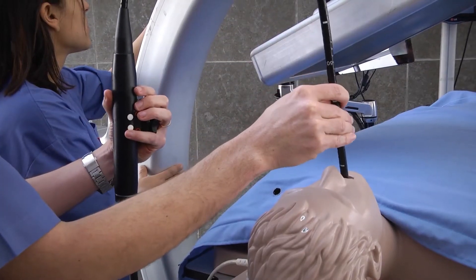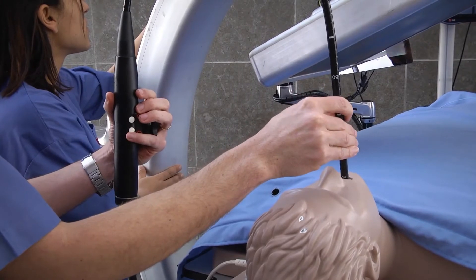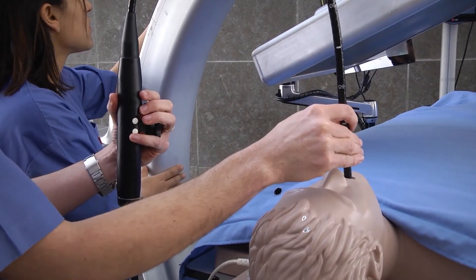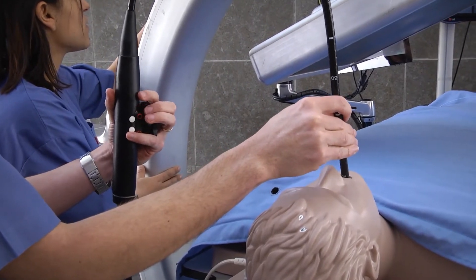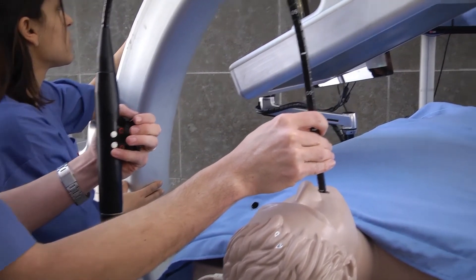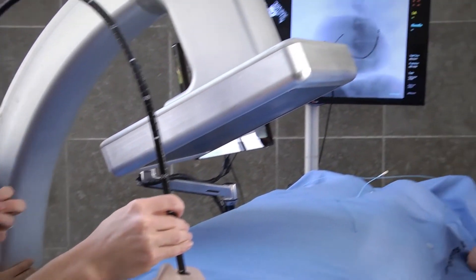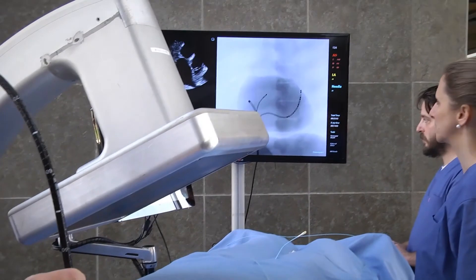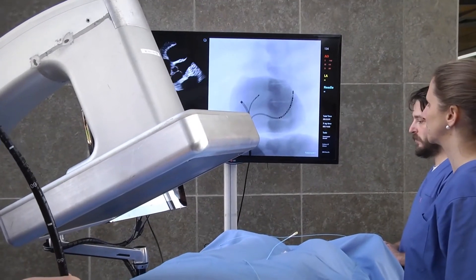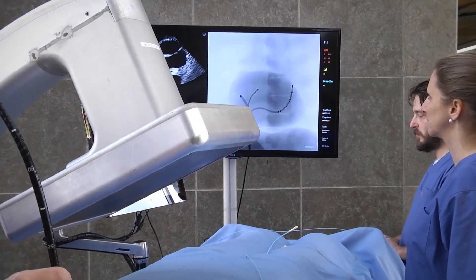An authentic TEE probe is integrated into the system and can be introduced through the patient mannequin's mouth to enable real-time training with an echocardiographist.